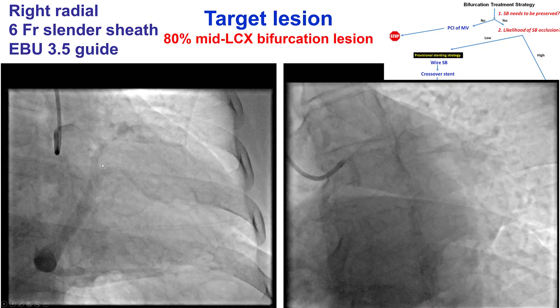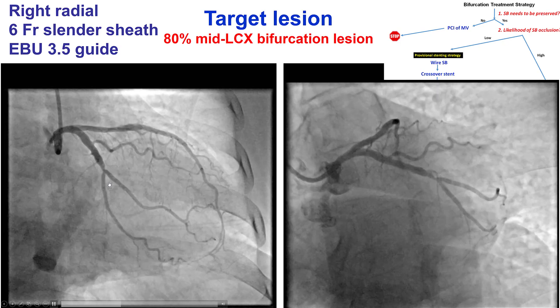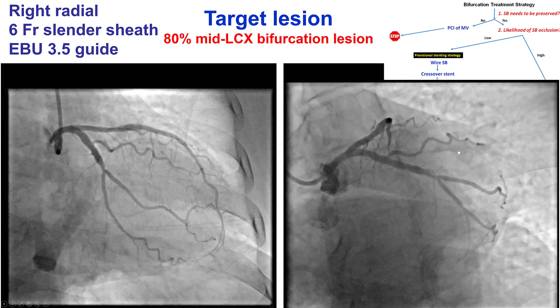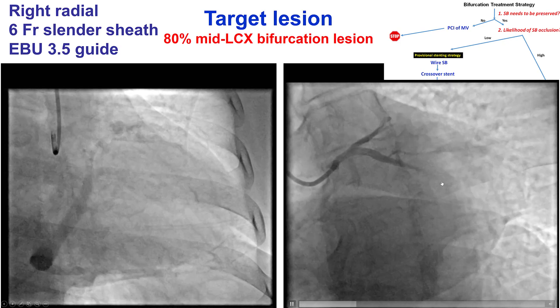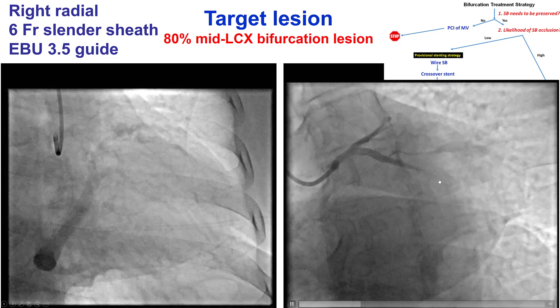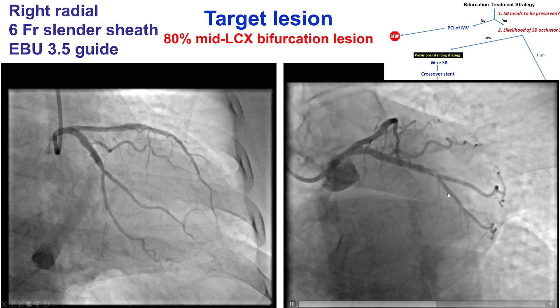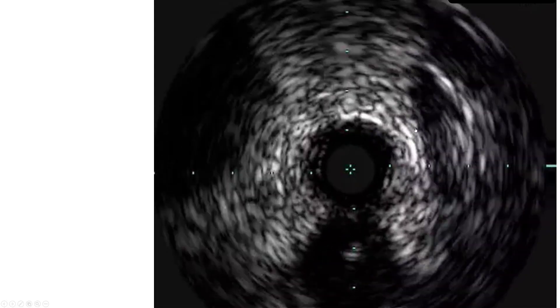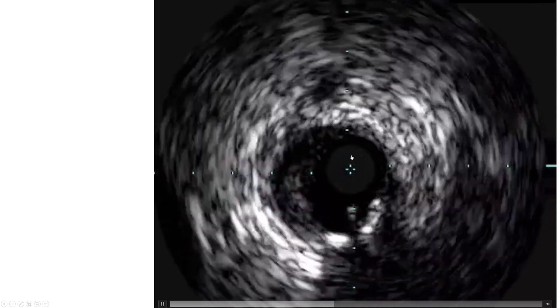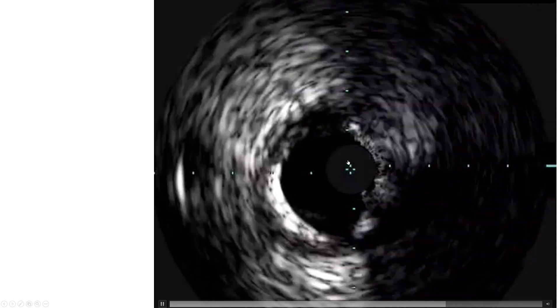Here is an example: a patient who has a bifurcation lesion in an obtuse marginal branch. The likelihood of losing any of the branches seems to be low because there is no significant disease at the ostia of either of them. However, both branches are large and need to be preserved. IVUS was performed. There is not much disease distally; the disease is mainly proximal. This is essentially more of a Medina 1, 0, 0 bifurcation.